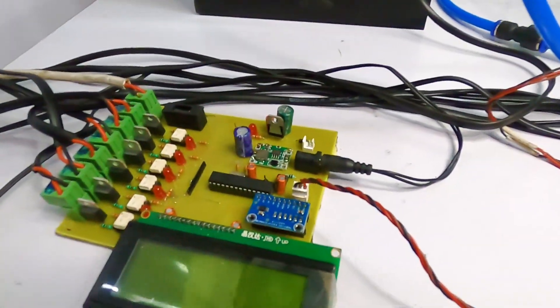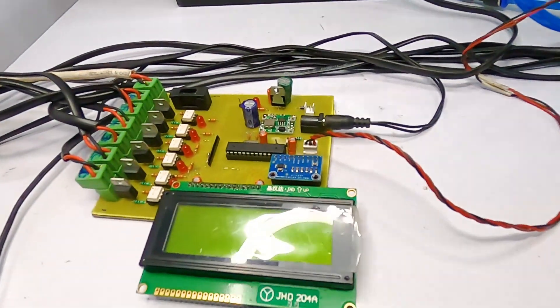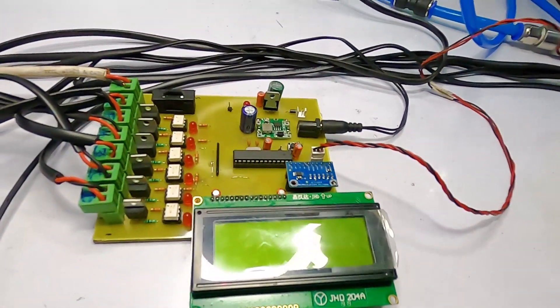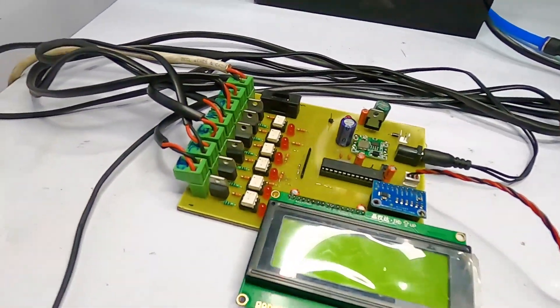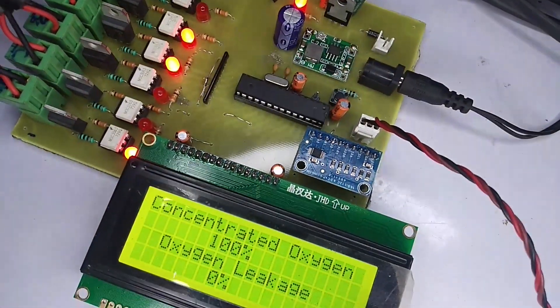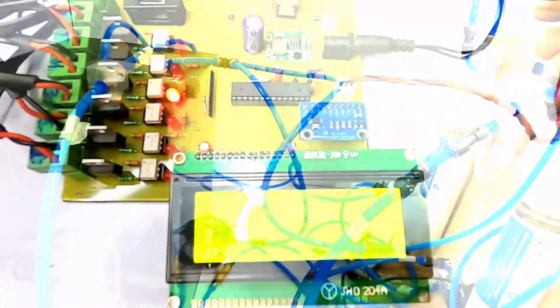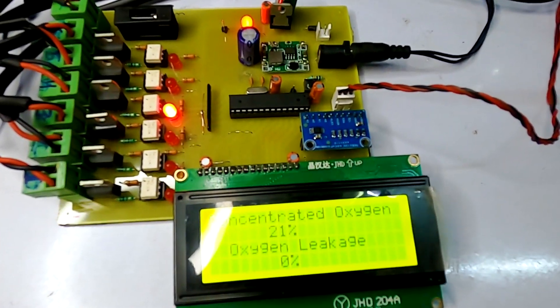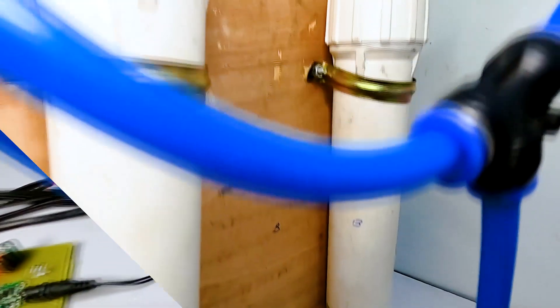Now this is the main circuitry. This is used to control the entire operation of the oxygen generator. This is used to control all the valves which are used to drive the air through the entire process. So this is how we control the entire operation of the system.